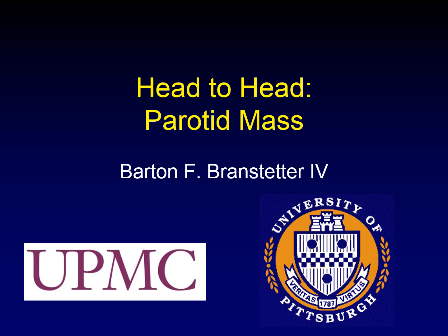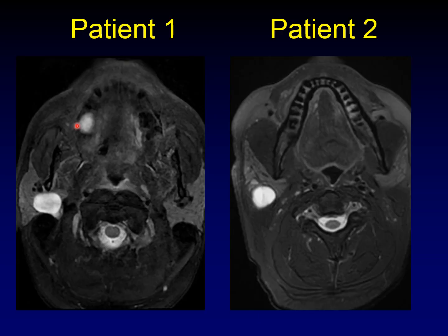In the head-to-head videos, there are two different patients with two different diseases that look a lot alike radiologically. You have to see if you can make the diagnoses on the two patients. Both of these patients have a bright T2 ovoid mass within the parotid gland. These look very much alike on these T2-weighted sequences, but even here you can start to see some differentiating features that might help you make a specific diagnosis.